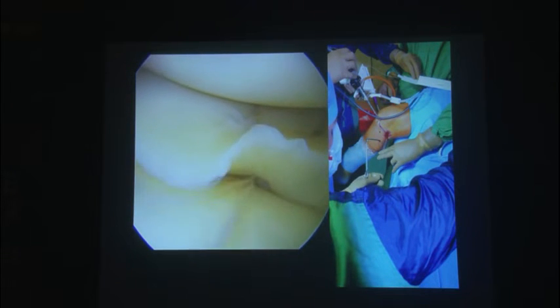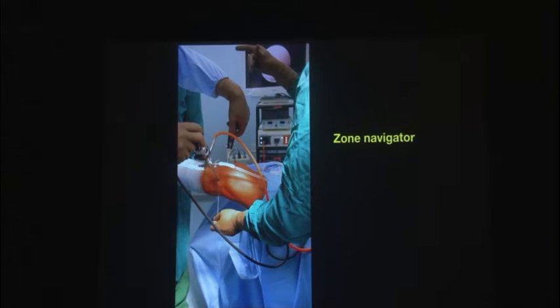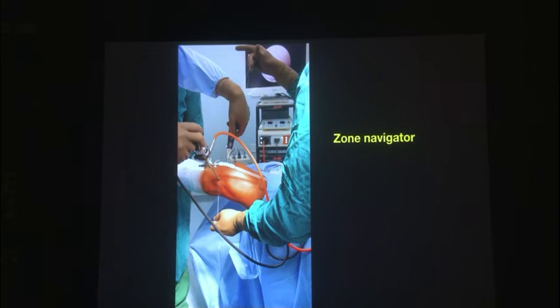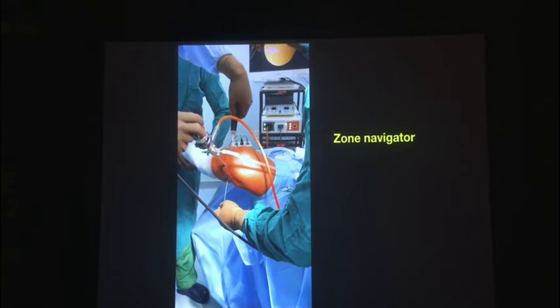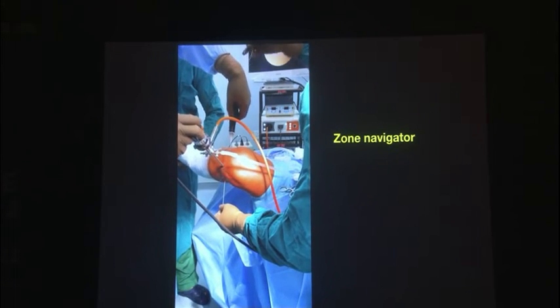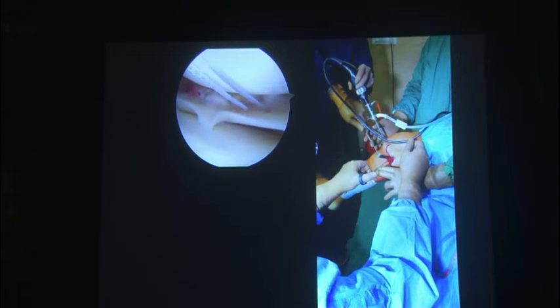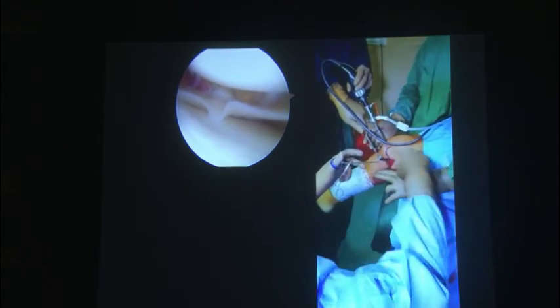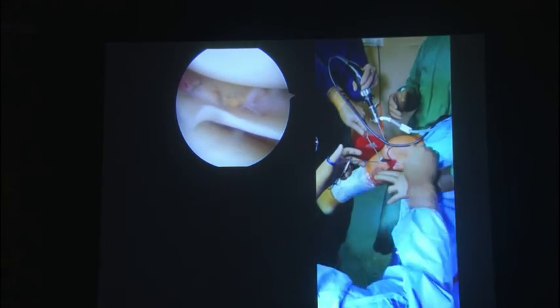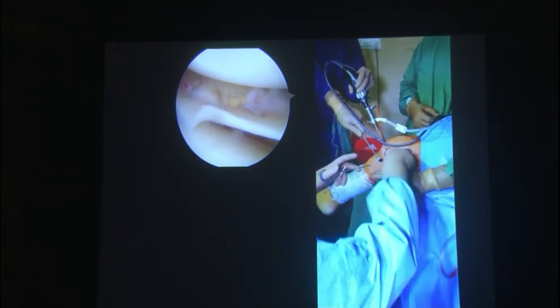For another undersurface repair tear like this, you would put at least four to six stitches above and four to six below. We also have other company devices which are much more ergonomic — you can use your thumb to push it through, and you can see my assistant flexing to make sure it deflects away from the neurovascular structures. Previously I used to pass all the sutures first, which created a lot of confusion. Now, as each suture is passed and retrieved, I tie a sliding knot immediately and cut it off at near-extension as possible. This makes your life very easy and creates a very nice, biomechanically strong construct.